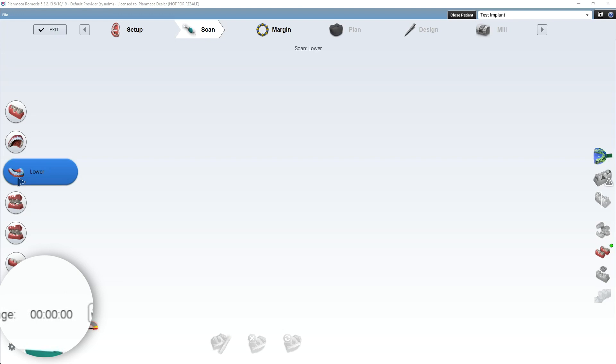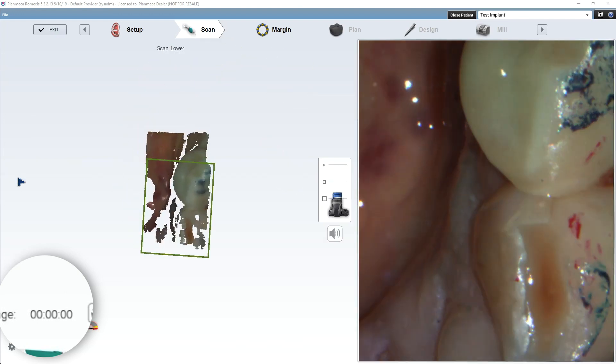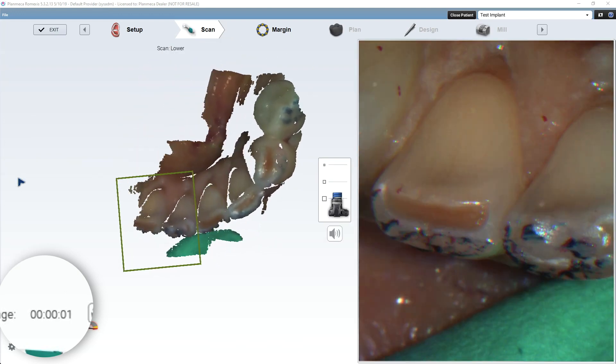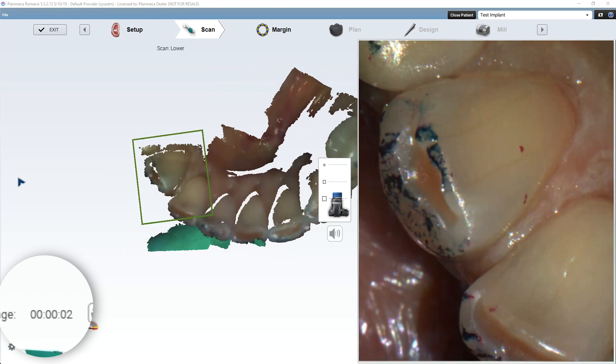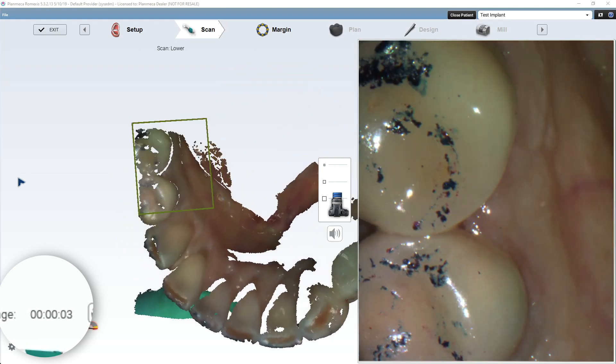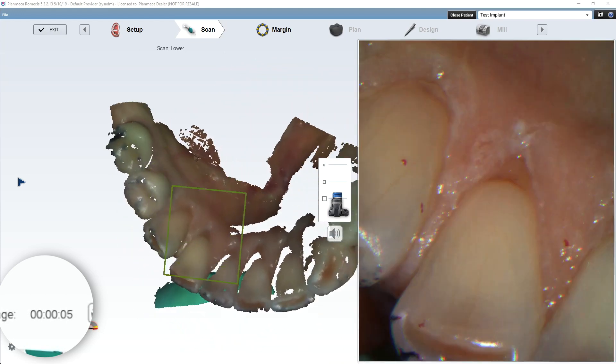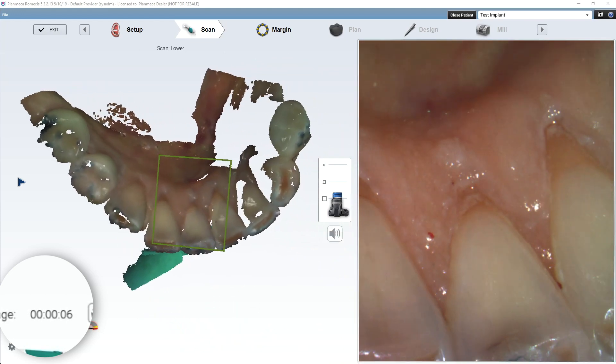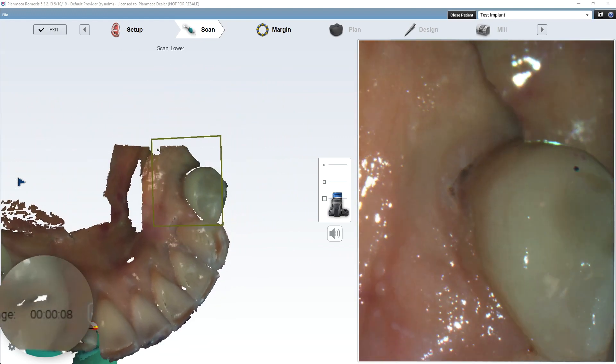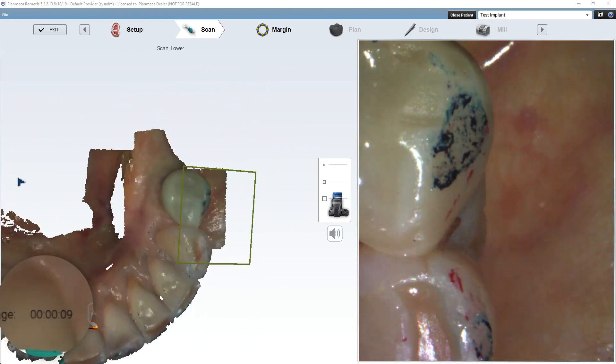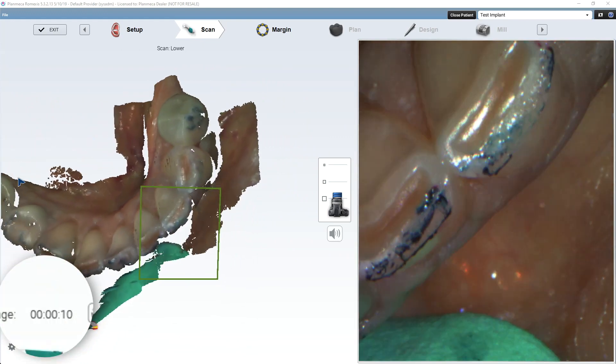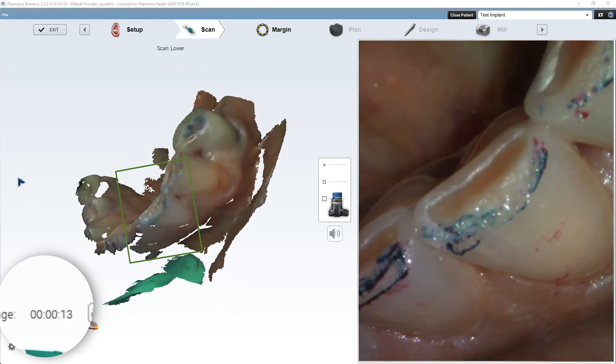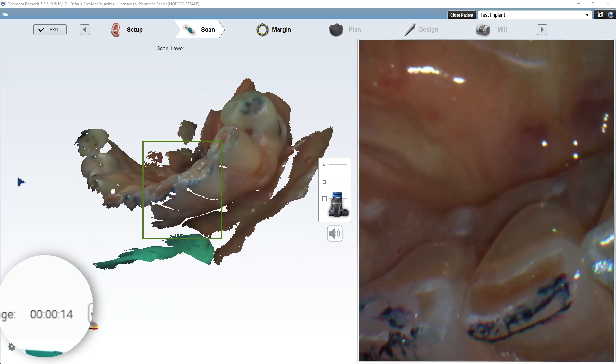Now I'm going to scan my lower. You're going to see the method to my madness here in a minute. It'll help you understand what's going on. So now I'm scanning my lower. I marked the occlusion. Sometimes I do that pre-operatively just so we can verify occlusal contact points if we need to.